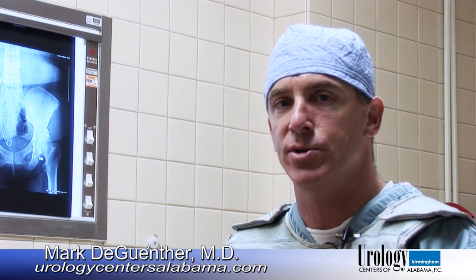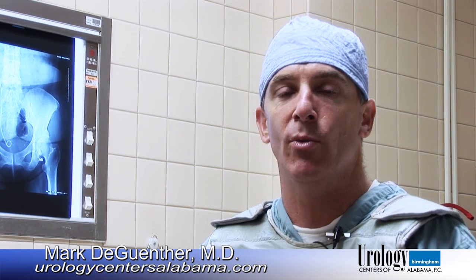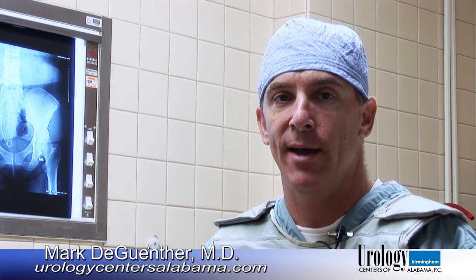The stent offers a measure of protection for the patient against having a stone fragment block them up. However, the disadvantage to a stent is that it does cause some discomfort to the patient in the post-operative period. Generally, the patient will feel some poking in the bladder area, and they will feel some pain in their side when they urinate while they have a stent in.